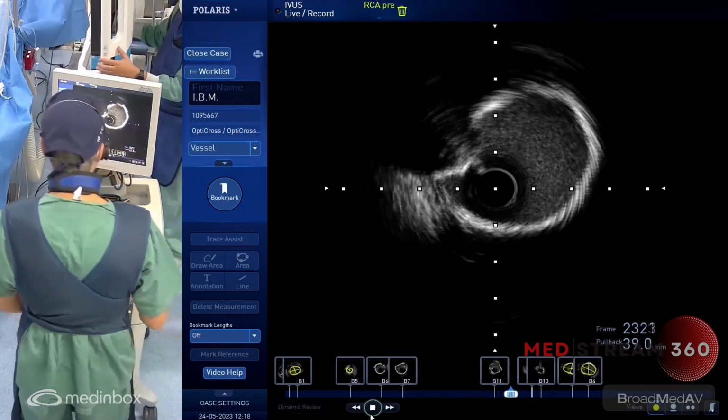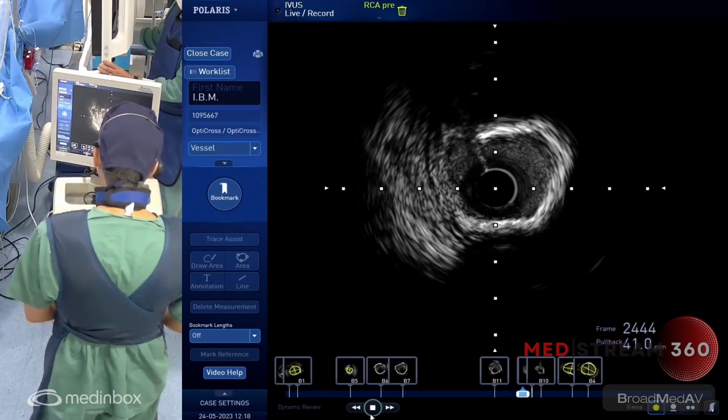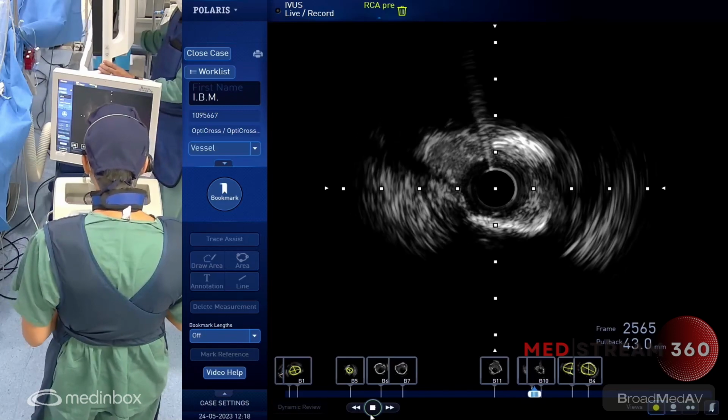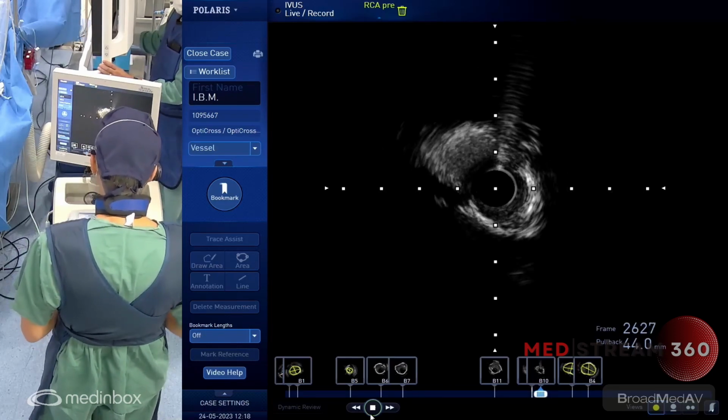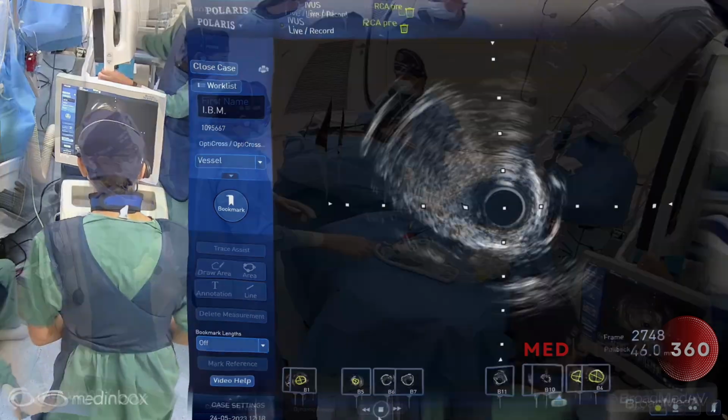that spot where we see the tightest stenosis. Here you start to see 270 degrees of calcium. That's one spot. This is actually 360 degrees. We see superficial and deep calcium in this lesion.